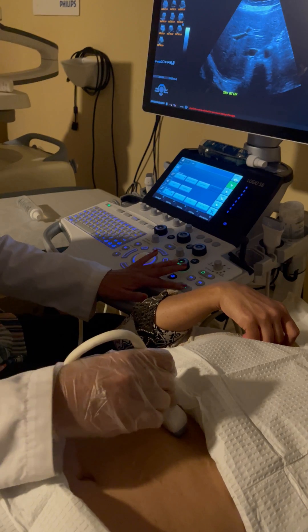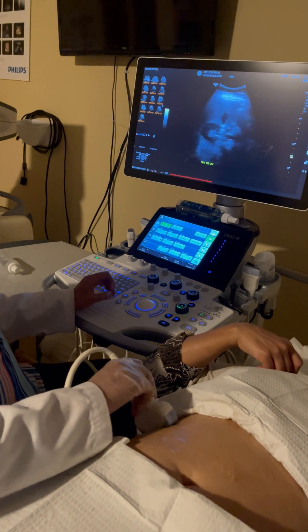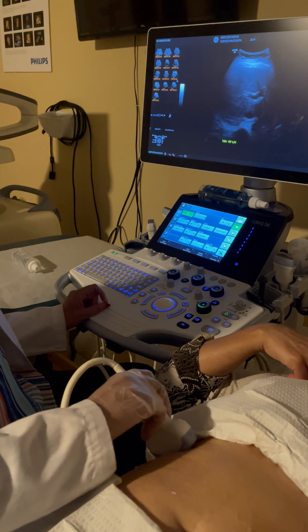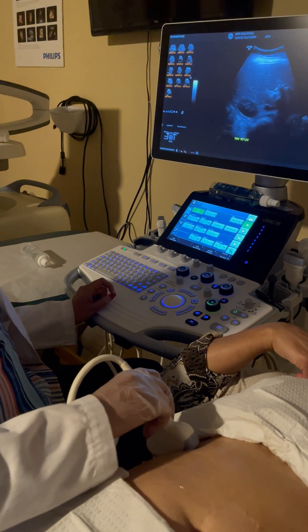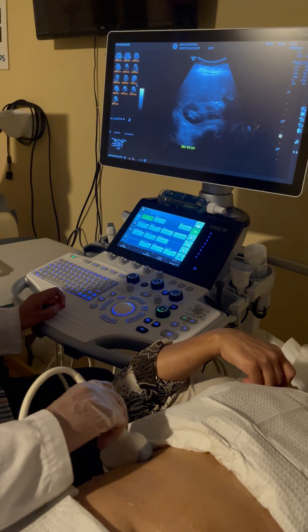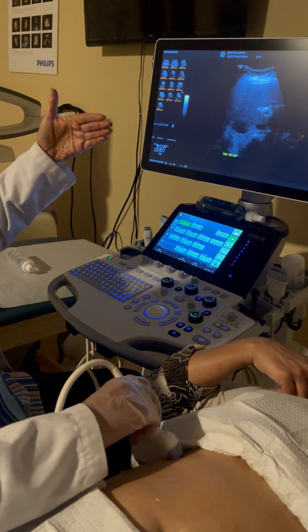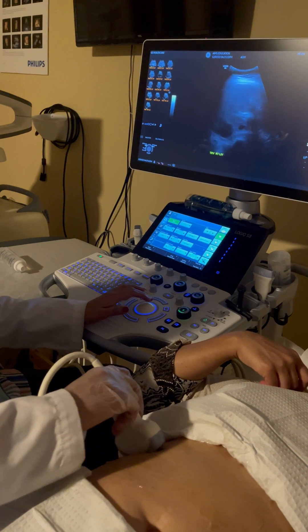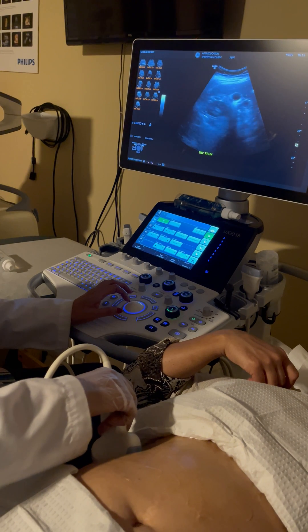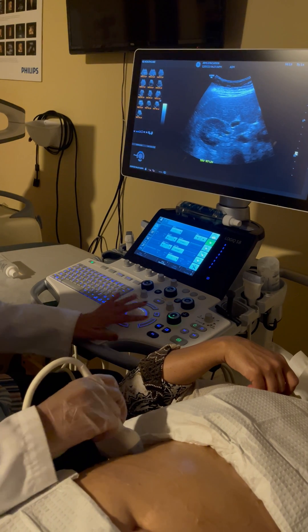I move my transducer more to the right side of the patient — sometimes coronal depending on the patient — to get an image of the right lateral inferior lobe, which borders the right kidney. I get a transverse image with the kidney, scan through the entire kidney to look for any masses, then come back up to capture the right lateral inferior lobe margin of the liver.